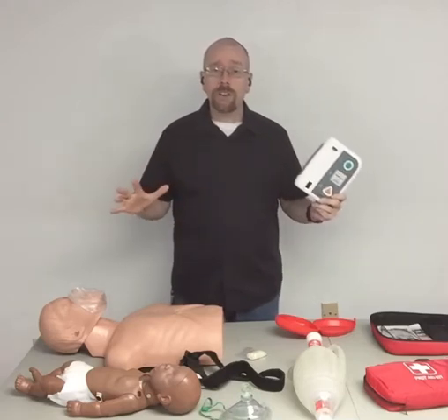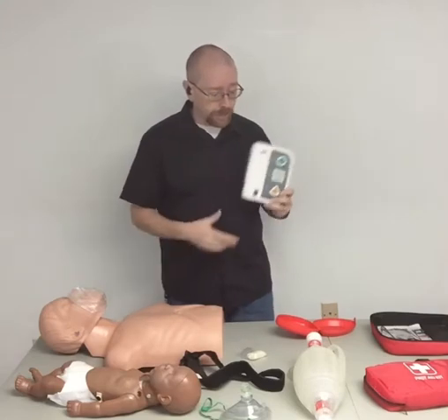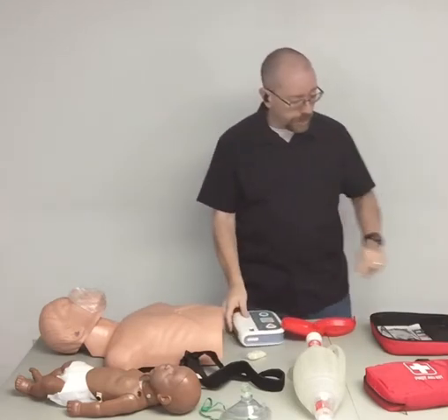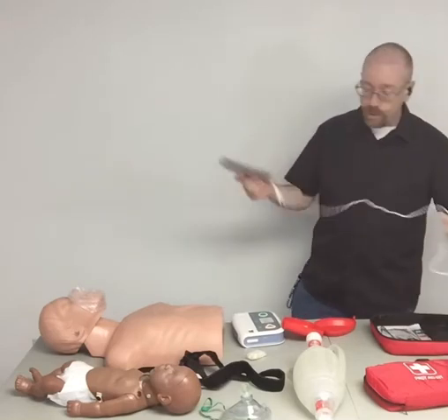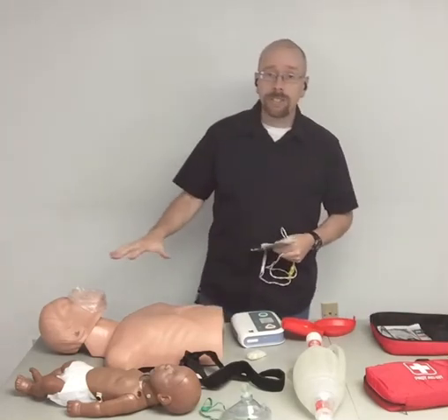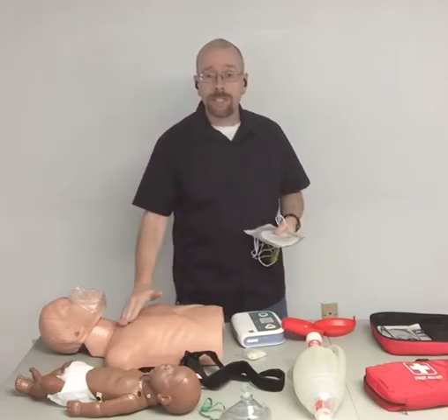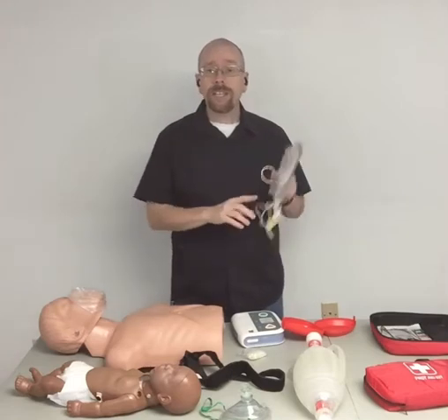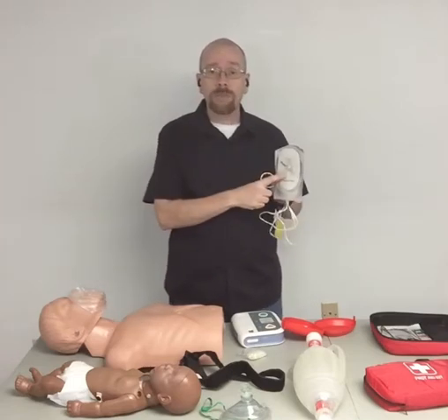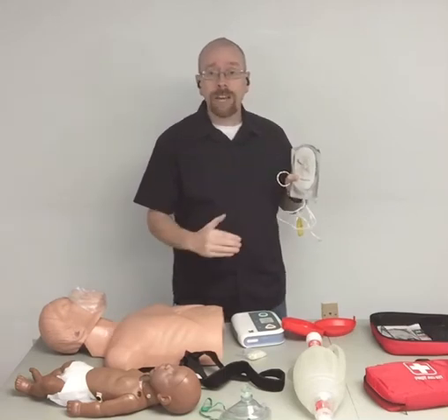Once we turn it on, it will tell us next to apply the electrodes to the patient's bare chest. So when it says bare chest, it means bare chest. If I take off somebody's shirt and they have a real hairy chest, I need to take a little surgical razor that's in the kit and shave that hair off. I may not have a razor. Then hopefully I have a spare set of pads or some tape. I'll apply that to the chest and then rip the hair off.